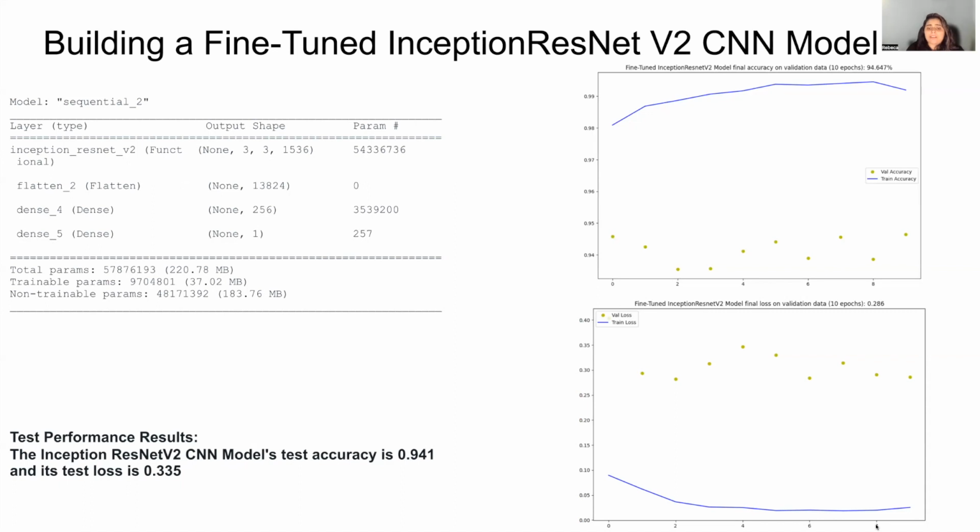The first step was to specify the convolutional base by accessing the Inception ResNet v2 model. The convolutional base weights were taken from ImageNet. The Inception ResNet v2 convolutional base is quite long and sophisticated. The final decision was to unfreeze and set to trainable the last 28 convolutional base layers.